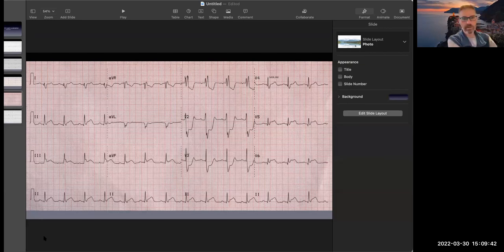All right, so I'm just going to take a look at some of the answers. Lateral, bundle branch block, inferior, question mark, ischemia, several bundle branch block, hypothermia, maybe some sort of mimic, Brugada, question mark. So the answers, lateral seems to be a common one. So the answers are a little more diverse on this one.